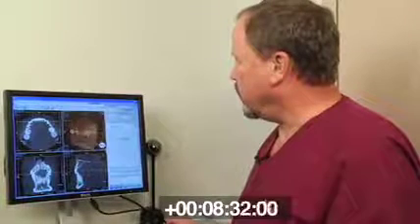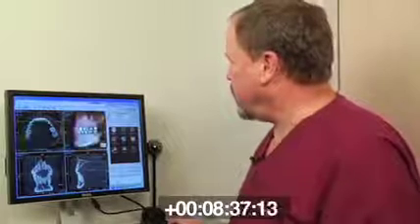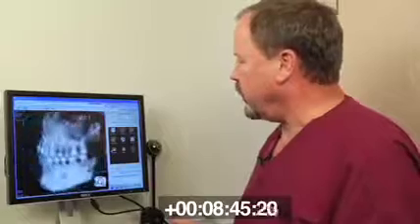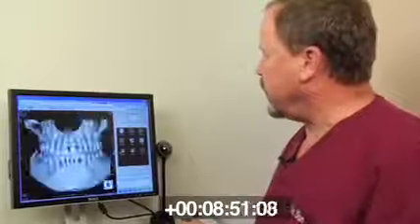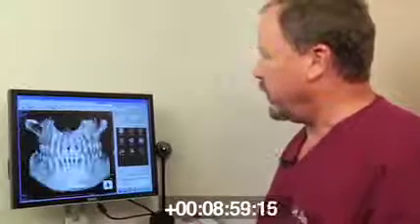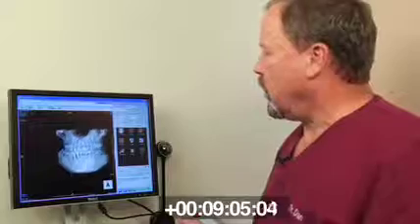But we're also able to look at the 3D image in any plane. We can change the templates to maximum intensity projection. We're able to go through and give a cursory look very quickly and see what things look like. We've got little cheat buttons for anterior, posterior, head, foot, right, left. So if you do get lost in space and time here, if you click one of these, you'll be right back to the home base. There's magnifying tools. There's all kinds of features that you're able to use instantly as soon as the scan is done. So that's one reason I like PreXion so much.